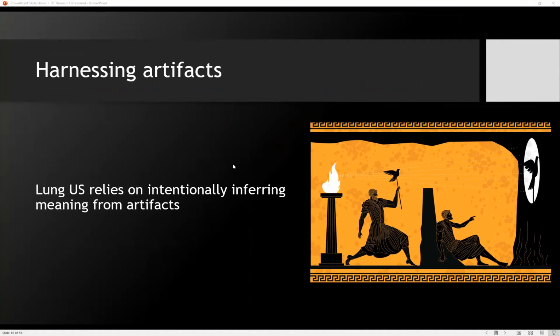Lung ultrasound for pneumothorax. The first thing to know about pulmonary or thoracic ultrasound is that, unlike cardiac echo, where you actually see the actual structures, lung ultrasound is sort of harnessing normal artifacts and identifying what's an artifact. Everything you see basically is artifact, and you identify artifacts that track with normal conditions and artifacts that track with disease. It always reminds me, not that I'm some well-read philosopher, of Plato's allegory of the cave, where you're just trying to make meaning out of shadows and whispers.